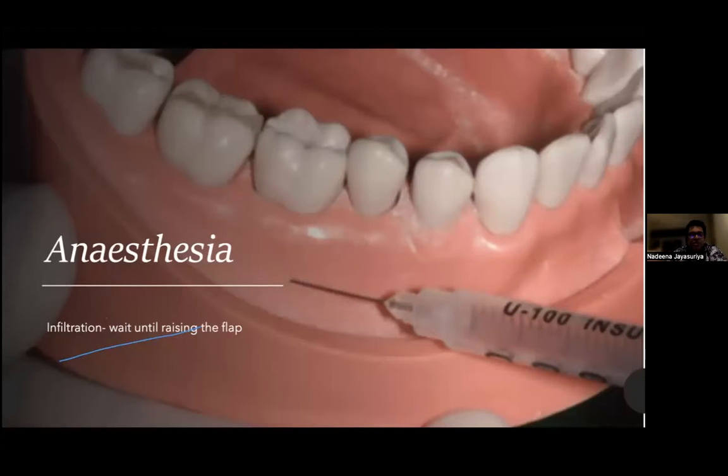If you just give anesthesia supraperiosteal, and within a few seconds raise a flap, the anesthesia has not gone into the bone. So as soon as you start drilling, the patient is going to get pain. So make sure when you raise a flap, you leave the anesthesia for a long time for it to nicely diffuse inside.